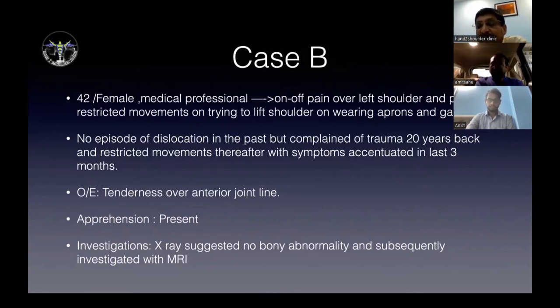The purpose of this conference is that there shouldn't be any communication gap. So we should not write only MRI shoulder. We should write MRI shoulder with an instability protocol. Instability protocol, correct. So this is a better thing.